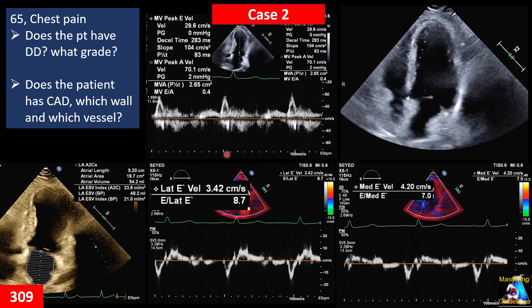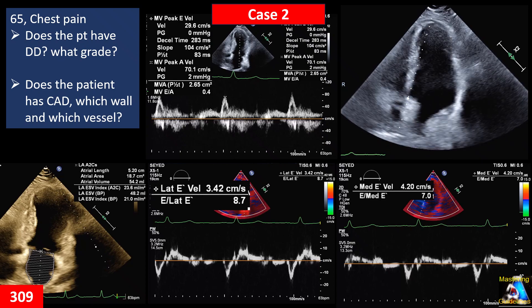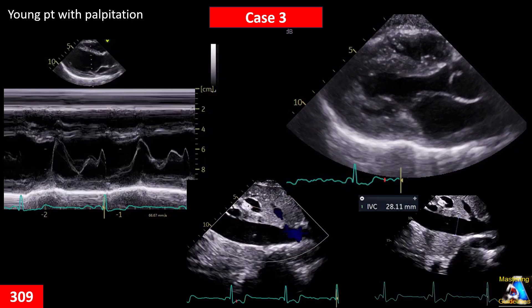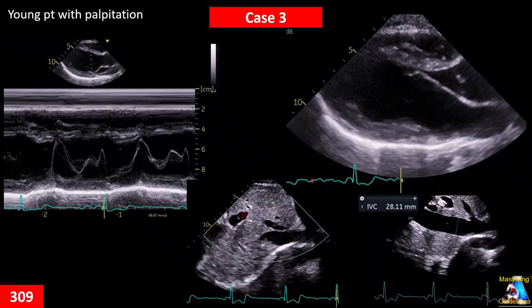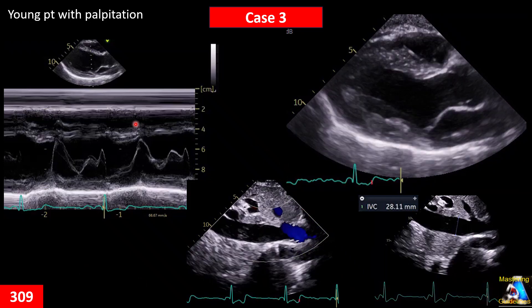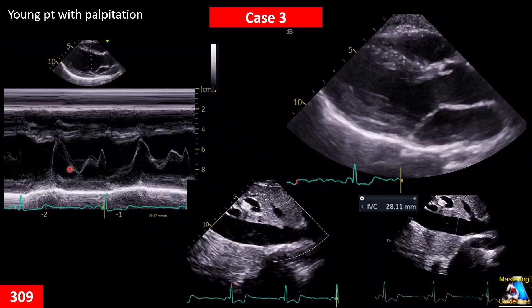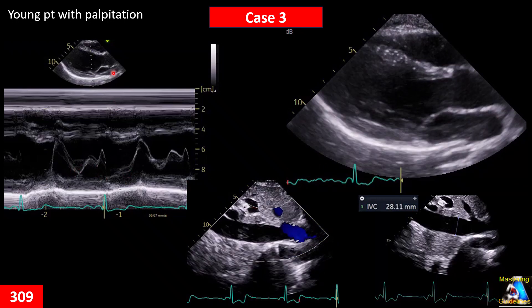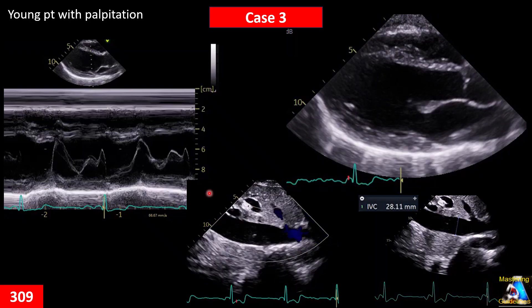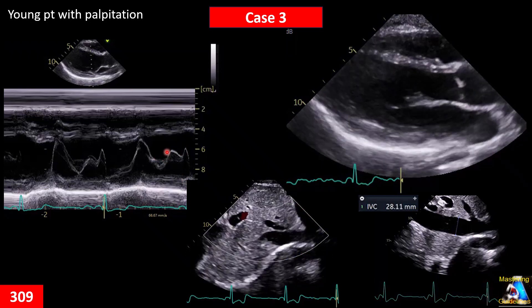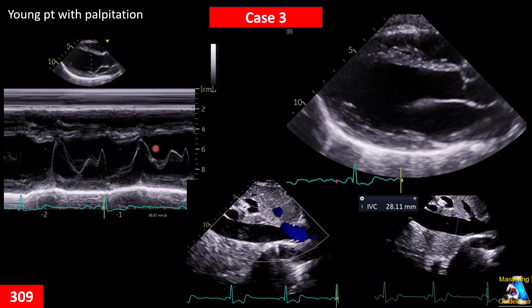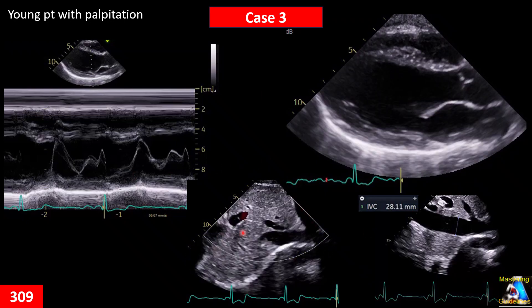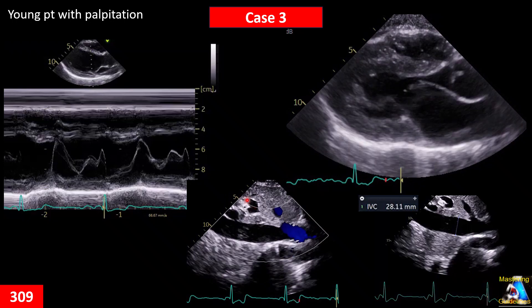Here we have a young patient with palpitations. An echo has been done and we have three images: one of them is clips on parasternal views, another is M-mode on the mitral valve, and finally the IVC. Does the patient have any abnormal finding? How do you interpret these findings just based on these three images and clips?